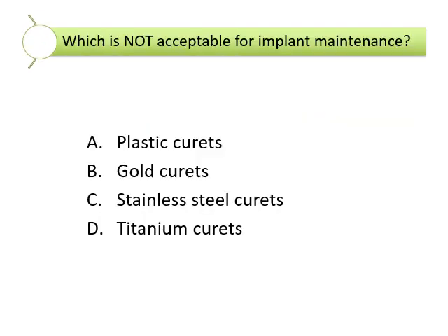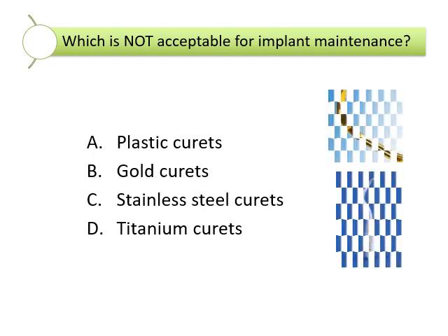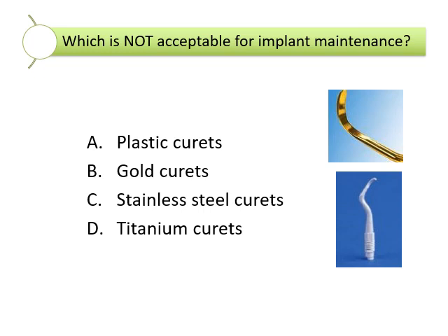Which is not an acceptable instrument for implant maintenance? Well, the textbook answer is stainless steel curettes. Stainless steel curettes.